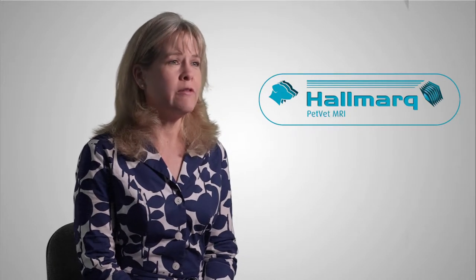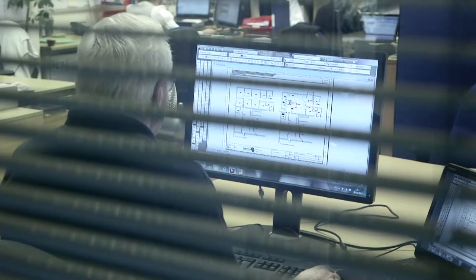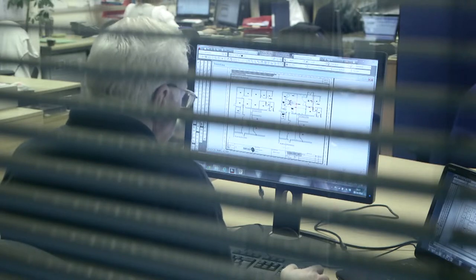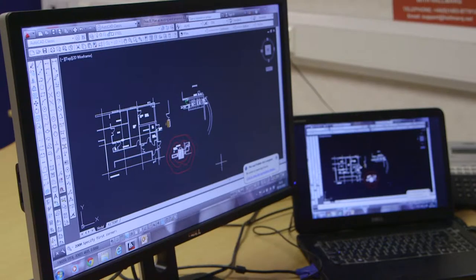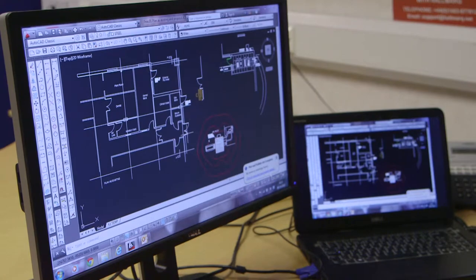I would suggest that the first thing that you do is send us a drawing of your hospital. That's really the best thing because we can look at it and decide all the important features as far as getting a high-field MRI machine into your clinic. So where's the elevator? Where's the road traffic? Where's the car park? Thinking about safety and where people will be working. So certainly if you can just send us a JPEG or if you just have a line drawing that you've done, just something of your hospital plans, send that to us. That's the first step and it's really where everything takes off and how we can help you the best.